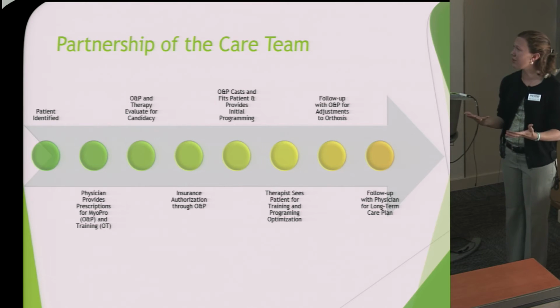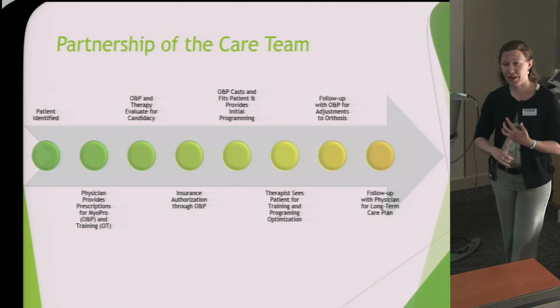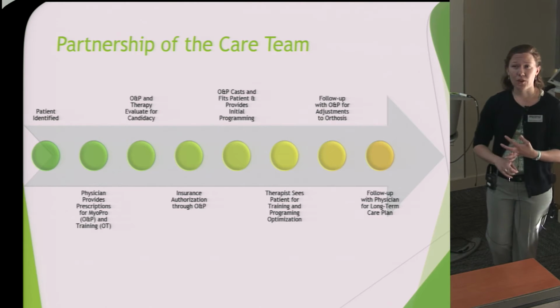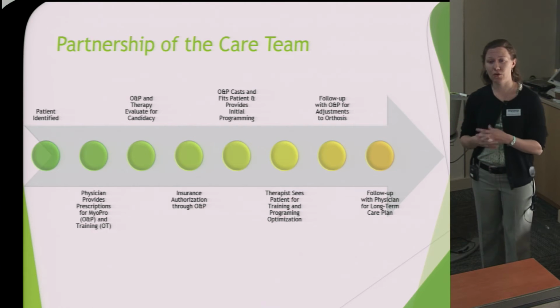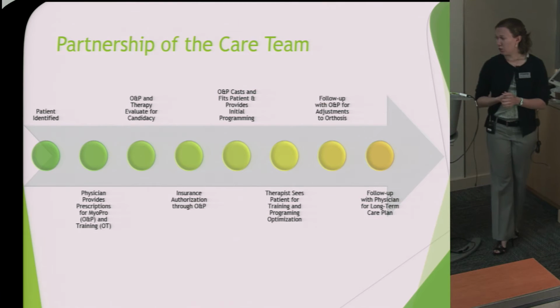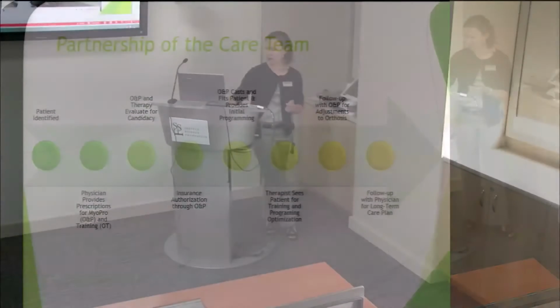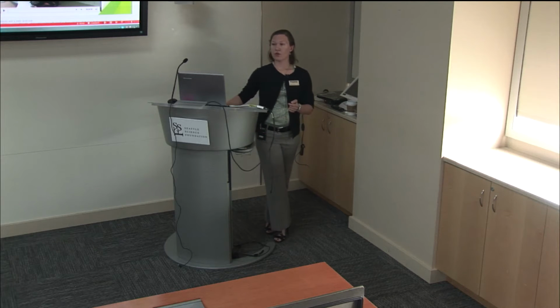And then, of course, the physician is important to provide the prescriptions for the O&P provider and the OT training and for long-term follow-up care and just ensuring that their overall health and needs are being met as related to their upper extremity. So this is an actual functional enhancement tool. This is not a training tool to augment presence. Correct.